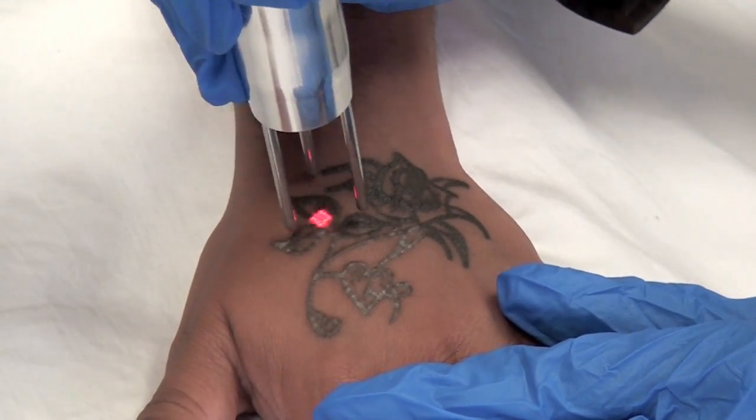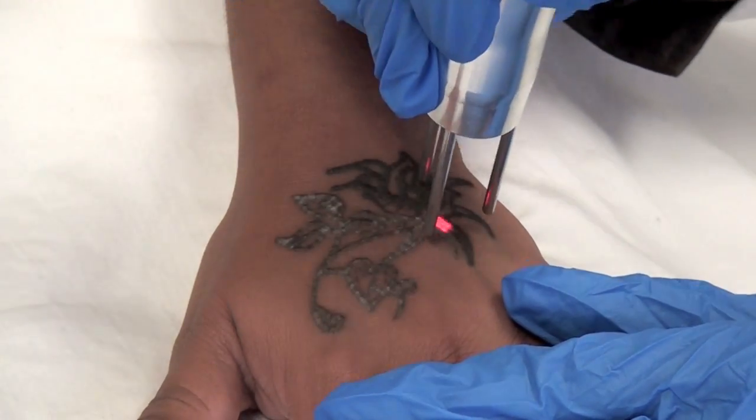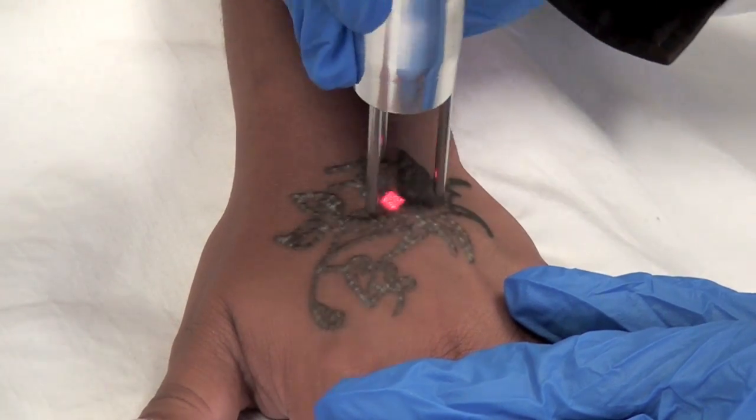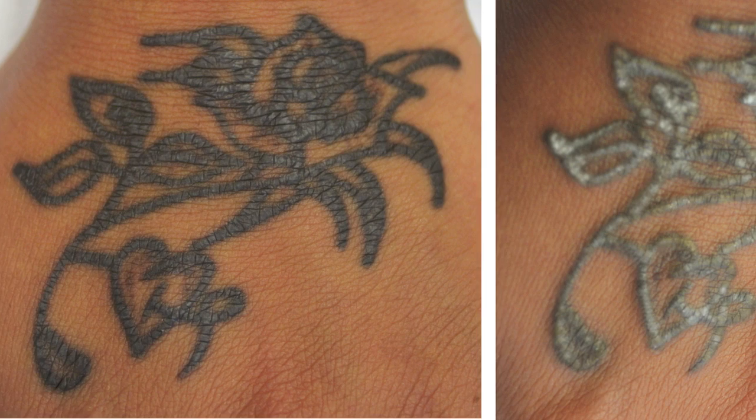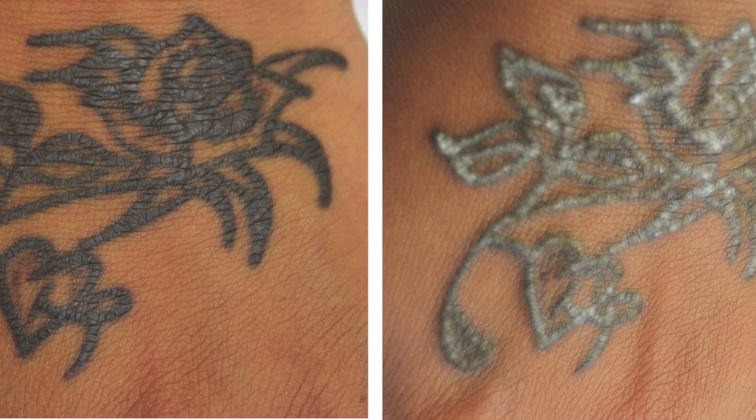We've accelerated the playback of this one-minute treatment for your convenience. The Duality's homogenized square spot is excellent for treating darker skin types because it minimizes the need for overlap while providing even energy distribution on the skin.